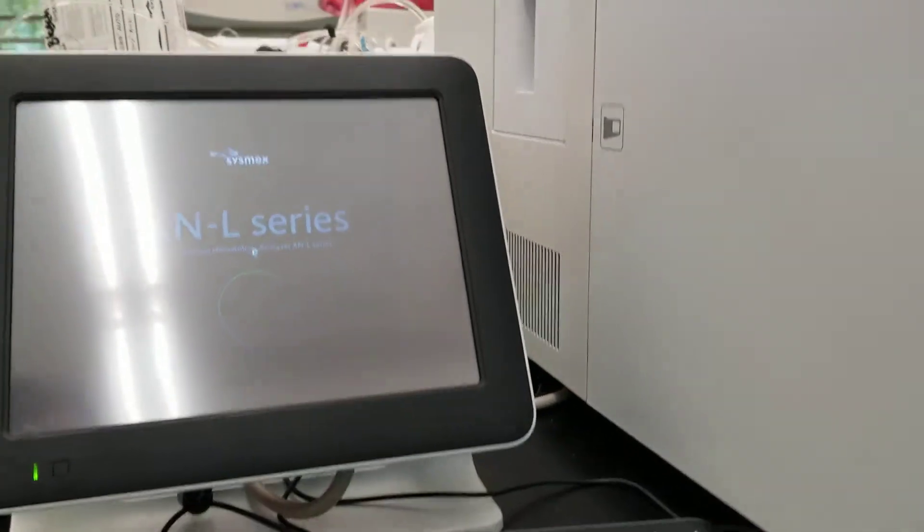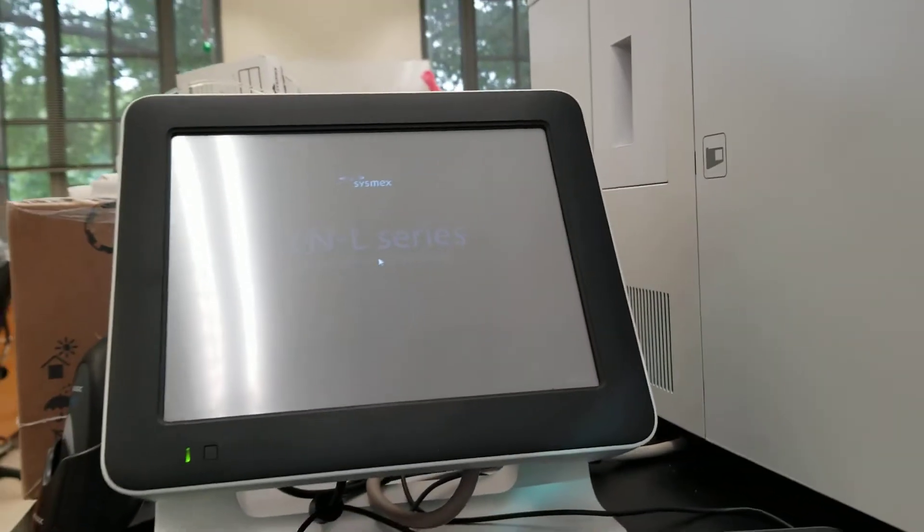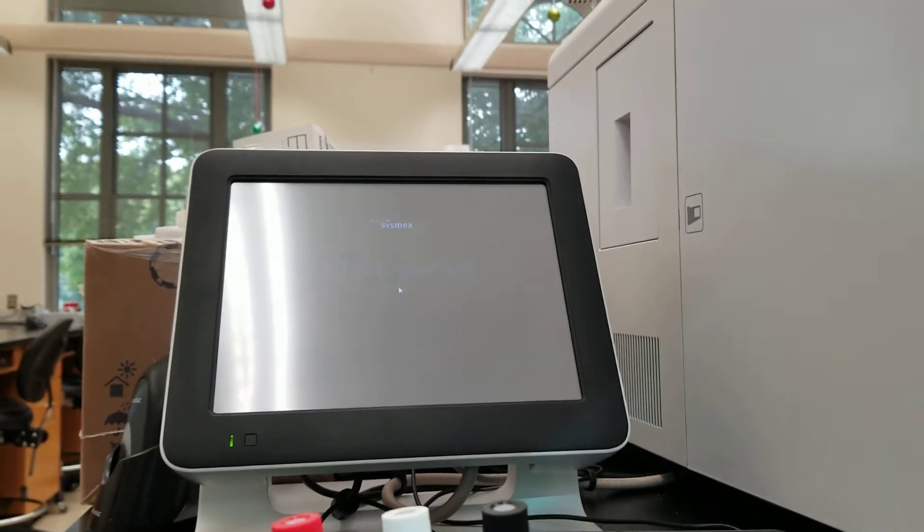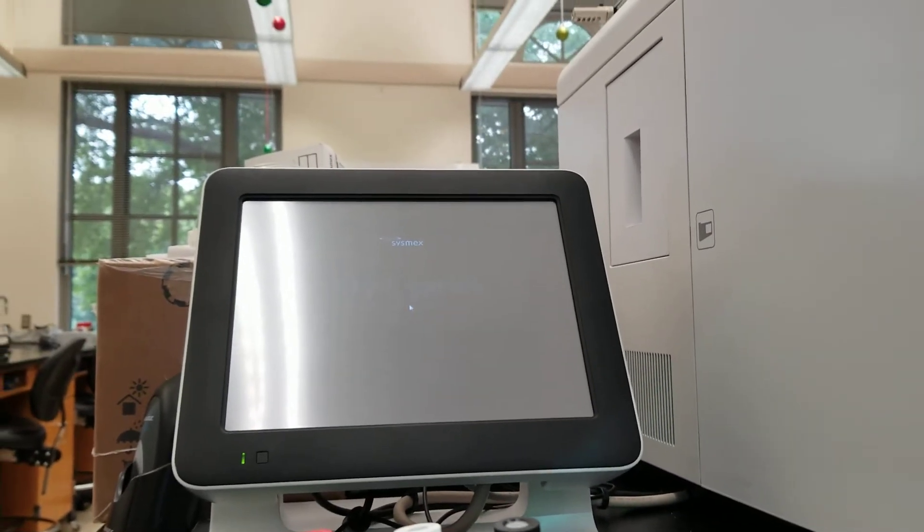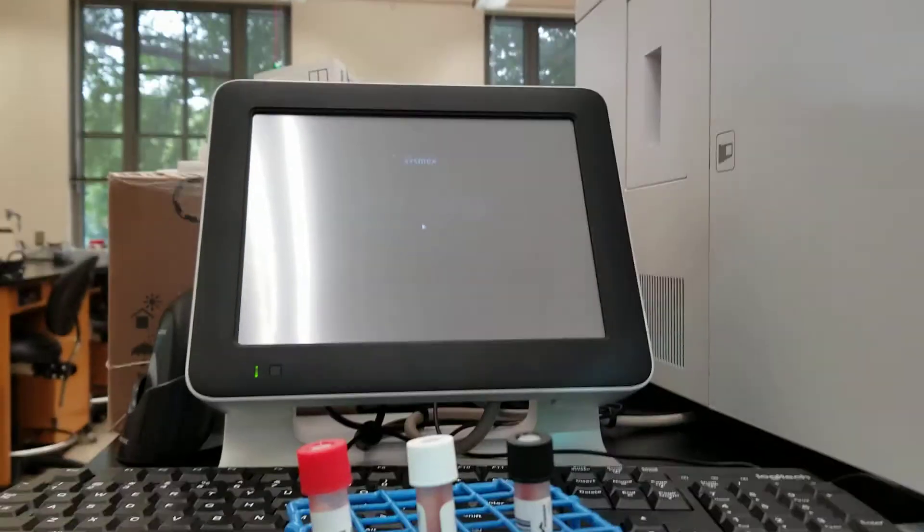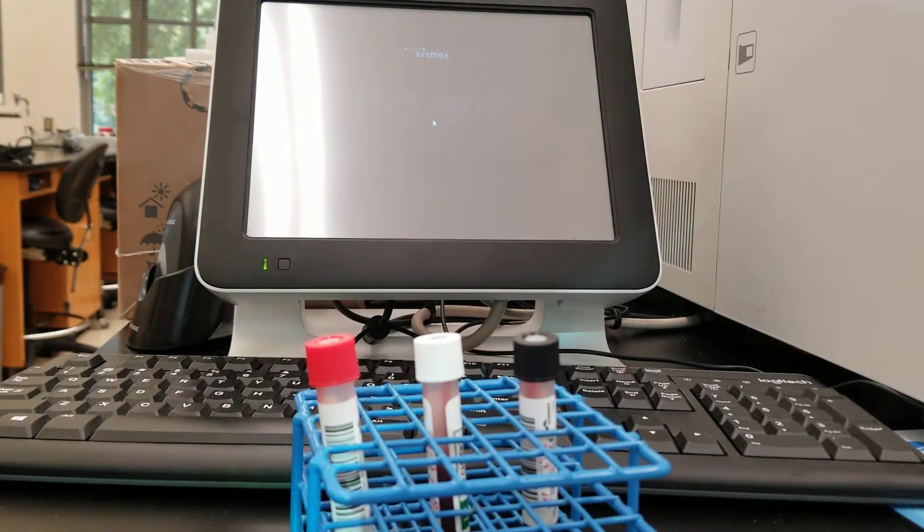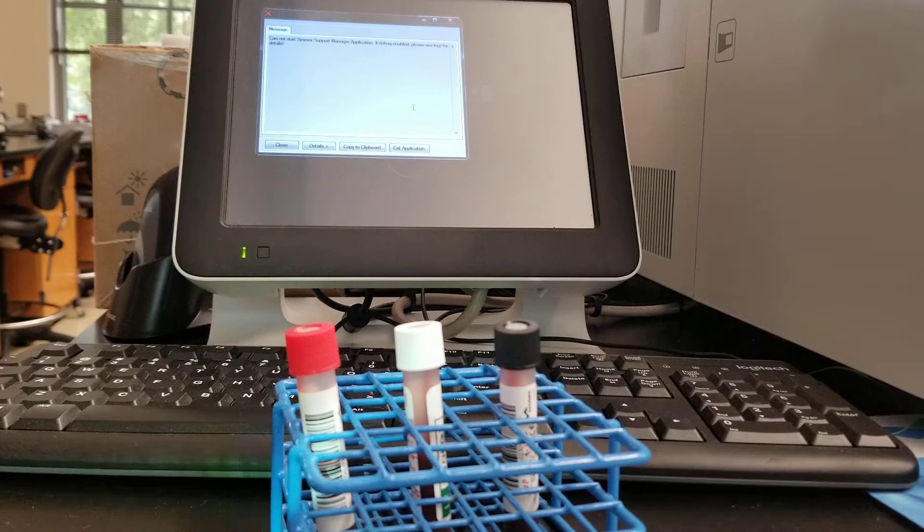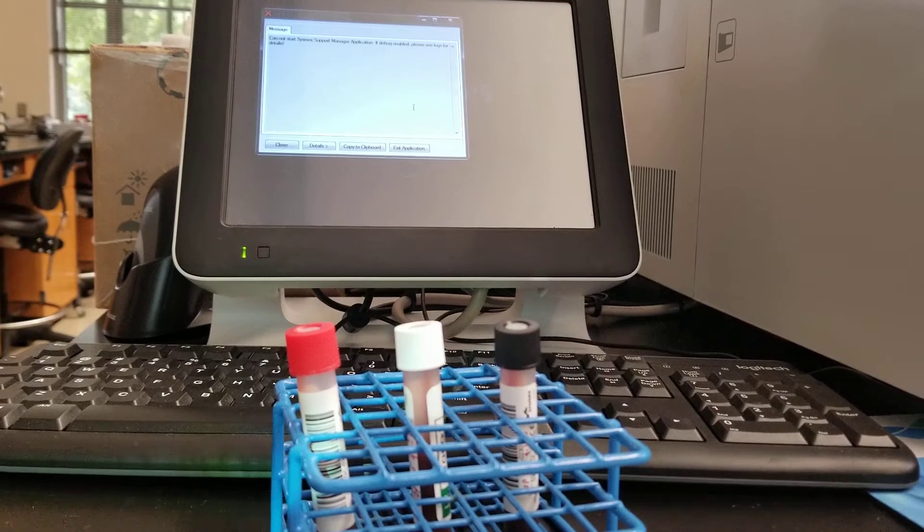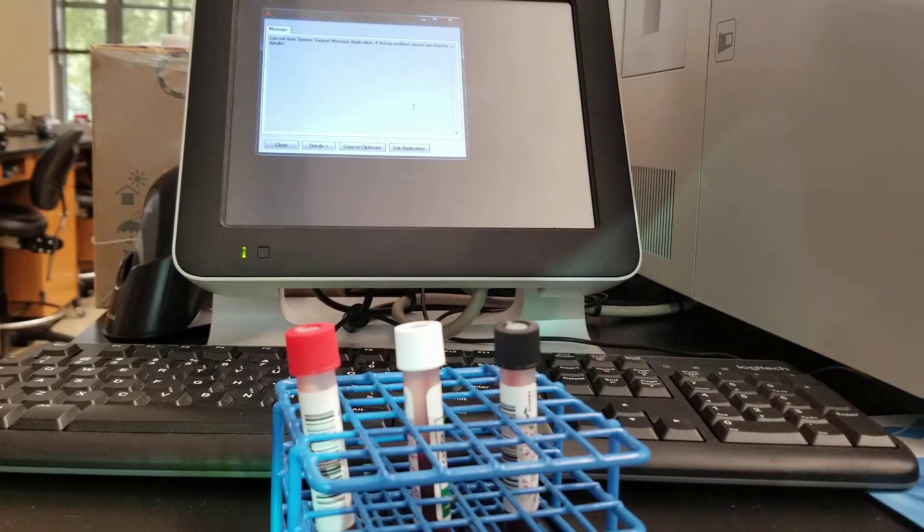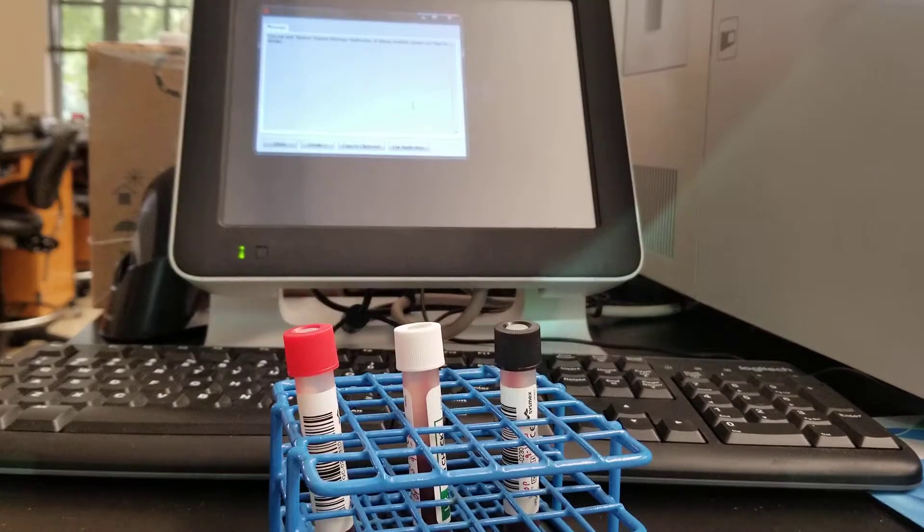The first thing that you want to do while you're doing that is make sure that you've got your QC out and the three levels are ready to go. It's running through some self-checks.